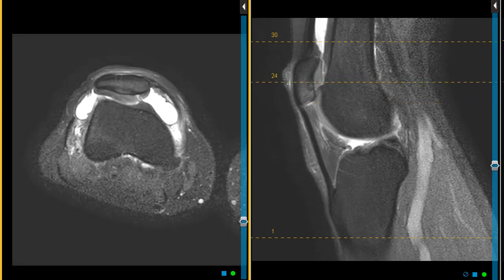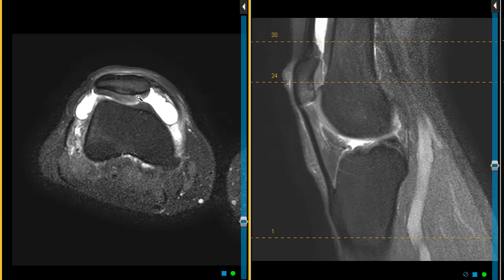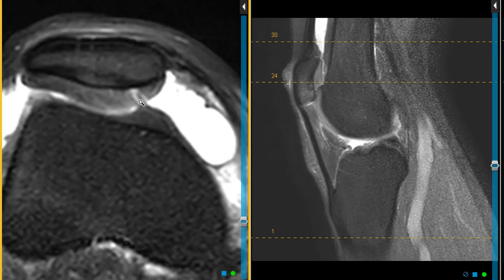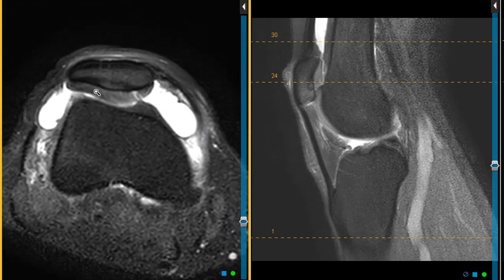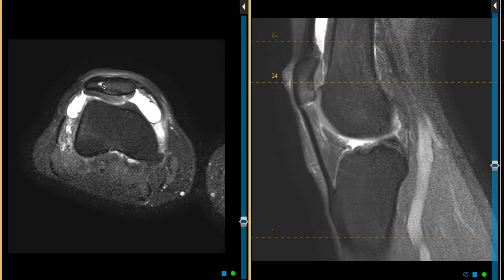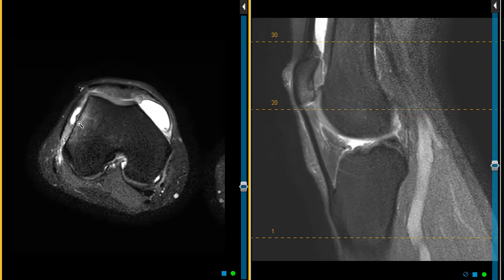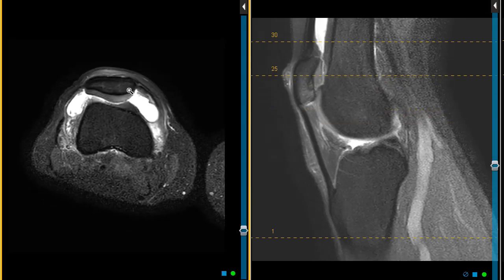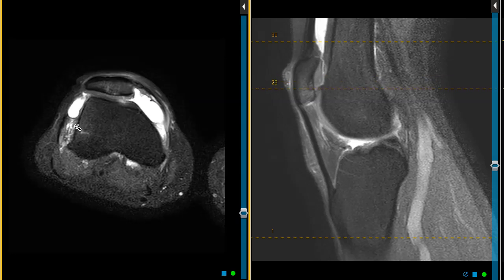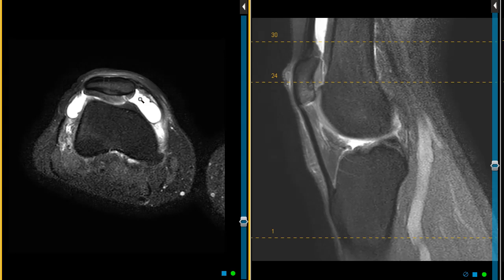We see she has an injury here of her cartilage — that vertical line is a little chondral fissure, a little tear of the cartilage. Her cartilage is the gray rind here. This is the middle, the apex. This is the lateral, and here's the medial patellar cartilage — it has an injury. With instability, the kneecap will jump out of the joint and impact out here in the lateral femur, leaving a bone bruise just like this. This fogginess is a bone bruise or bone contusion — this is normal darkness, and this is abnormal brightness. This is evidence of a transient patellar dislocation. The kneecap dislocated, impacted, caused a bone bruise, and jumped back to normal position. She's left with a chondral fissure and a joint effusion.